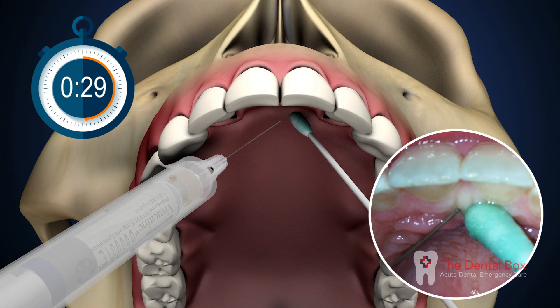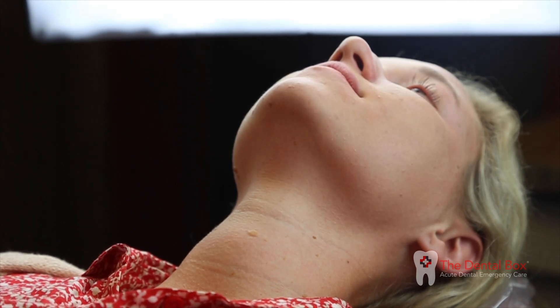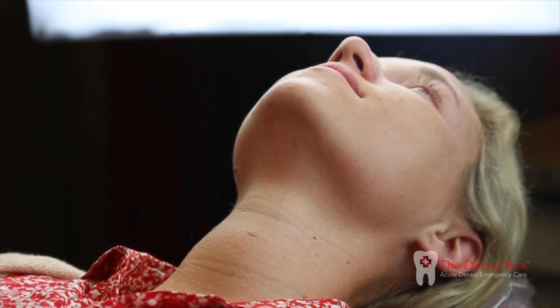You should feel considerable resistance in the syringe. Withdraw the syringe, cap the needle, and wait 2-3 minutes for soft tissue anesthesia to set in.